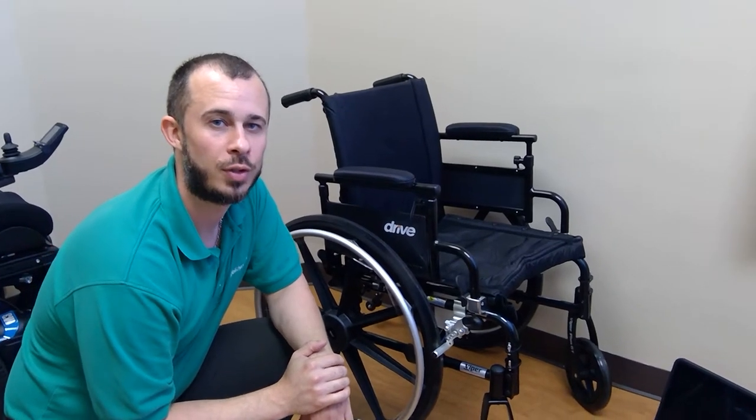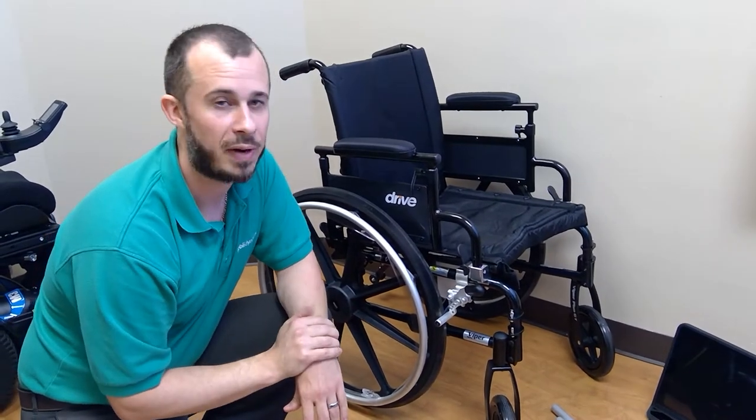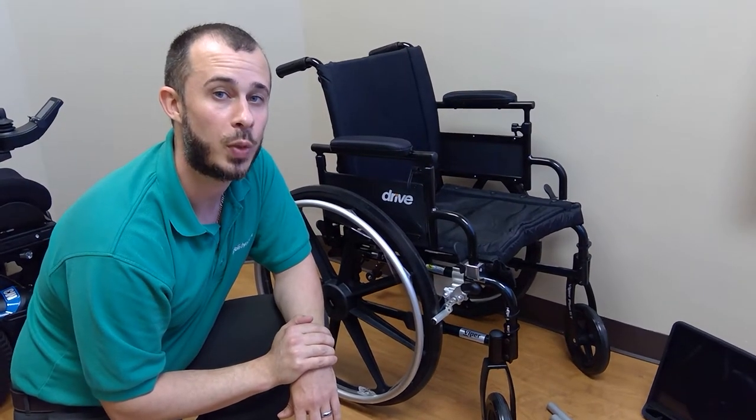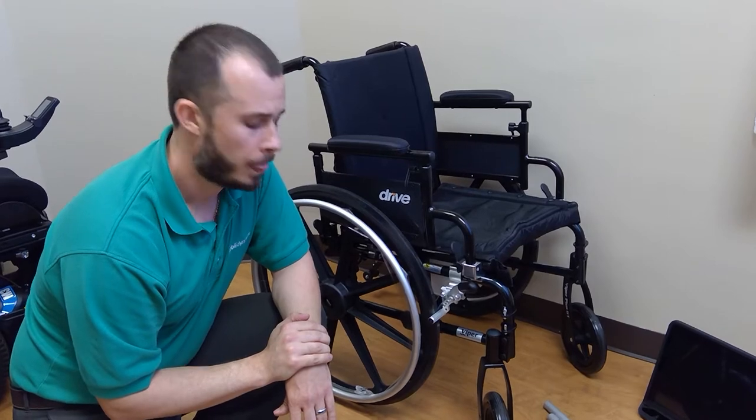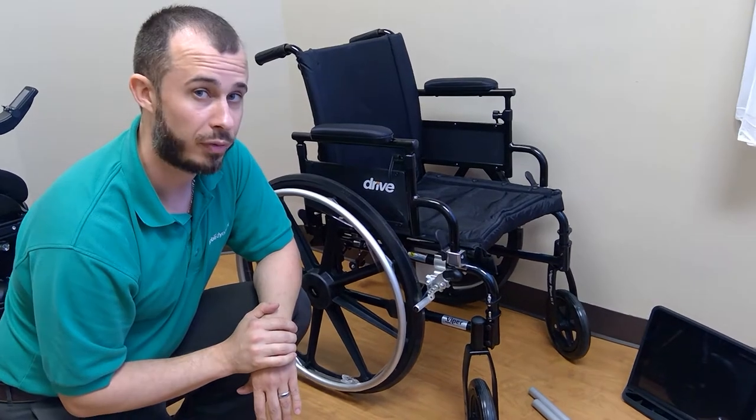Hi guys, this is Chris Kovach, Solutions Consultant in Northeastern Florida for Tobii Dynavox. In this video we're going to cover how to install an S-tube mounting system from the Connected line onto a standard manual wheelchair. In a previous video I talked about how to choose and verify the size mount you would need for this type of chair, so if you have any questions on that please refer back to that video. What we're going to do now is look at the two options and I'll show you how to install from there.